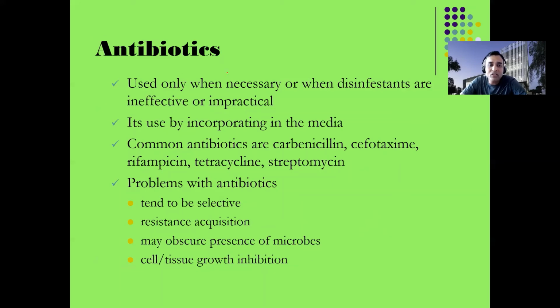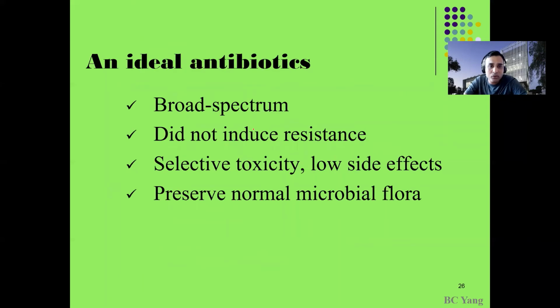Antibiotics can be used. As I already mentioned, there is a large variety of antibiotics like carbenicillin, rifampicin, tetracycline, and streptomycin. There are so many different kinds that can be used. They are selective; every antibiotic is specific. So it will never guarantee that the antibiotic is going to kill your bacteria, because now a lot of bacteria, even normal ones, are already multi-drug resistant. So an antibiotic will never provide any guarantee unless you use one with multi-drug capability, the broad spectrum antibiotics, right? My suggestion is not to use them.